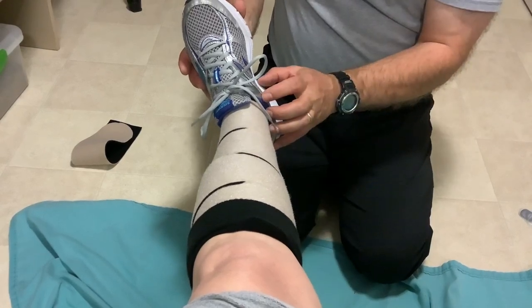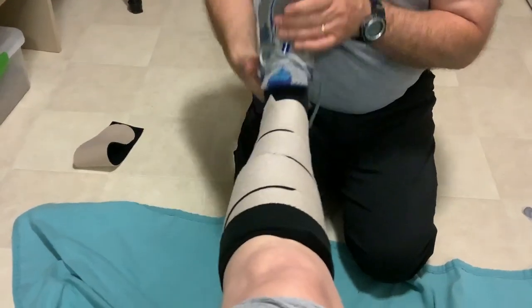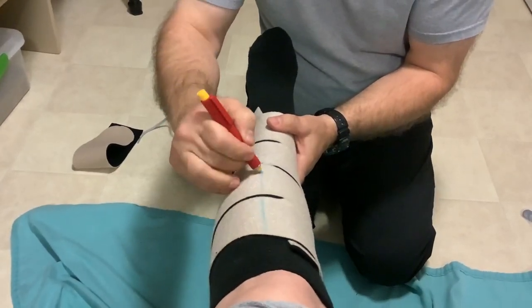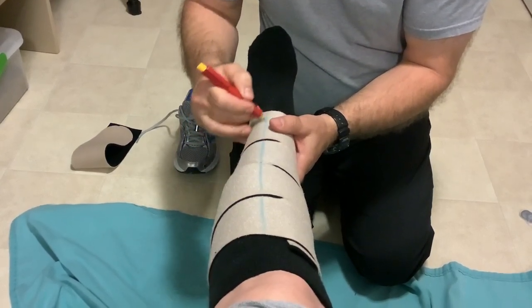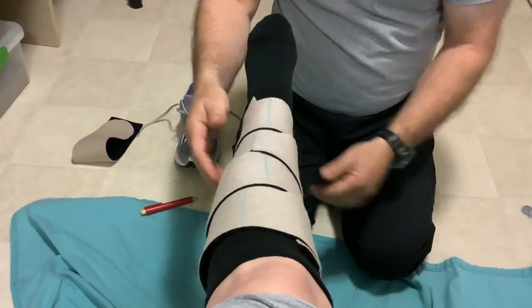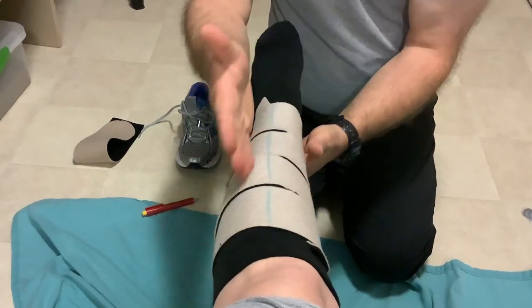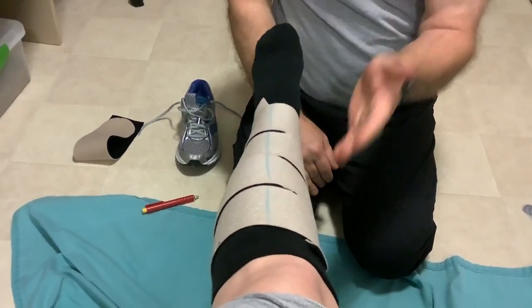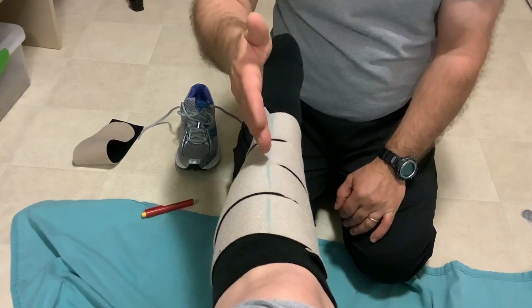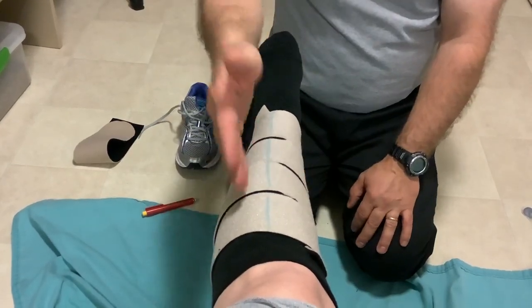If you have a longer person, just put that extra strap on. To make sure your patient can replicate the same amount of tension, go back and mark it with chalk — in the clinic I often use plate chalk. When the marks all line up, the wrap is tight enough. As the patient learns to pull the wrap, they'll know that when the line lines up, it's exactly as tight as you got it. You'll teach them a time or two and they should be pretty good at it. Remind them this is the minimum pull when the marks line up. As they shrink in size and decongest, the marks will get further apart — but that aligned position is your bare minimum pull.